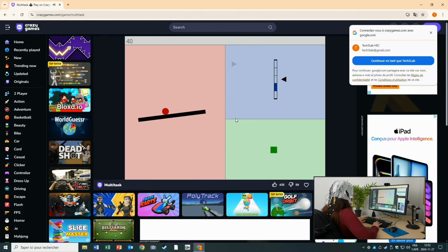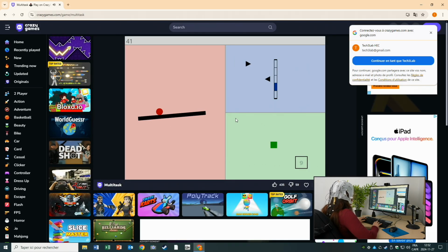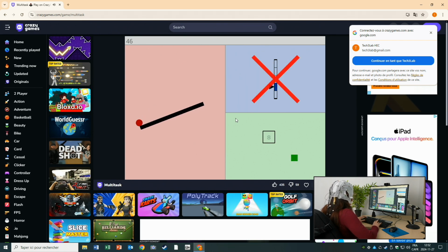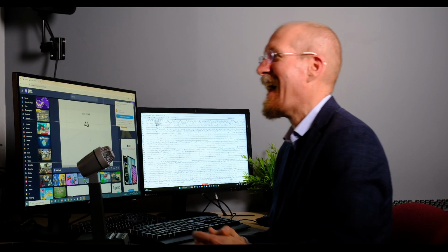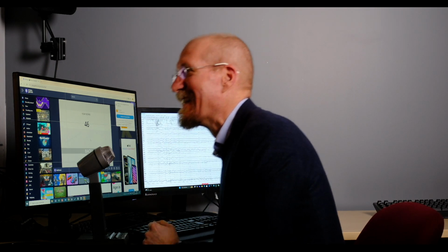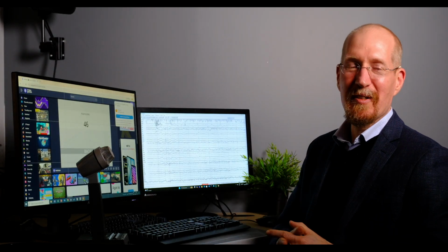So keeping two things in equilibrium is relatively easy. Once we get to 3, you can see that the difficulty is exponentially higher. Very good. Good job. It's okay. It's supposed to be impossible. Okay. So Anne has been a very good sport.